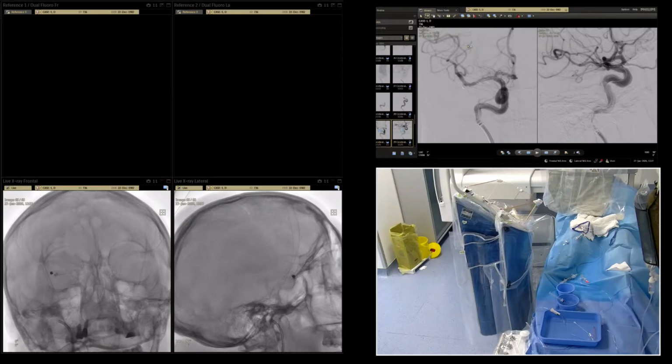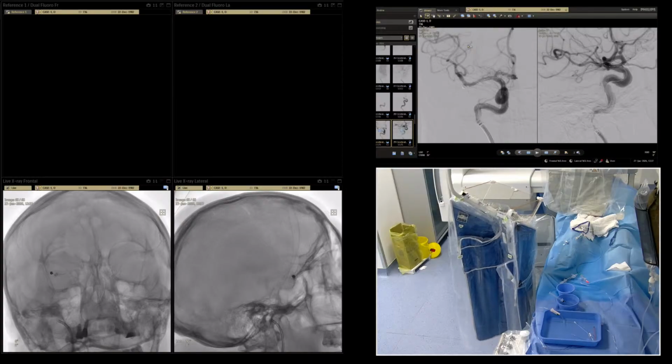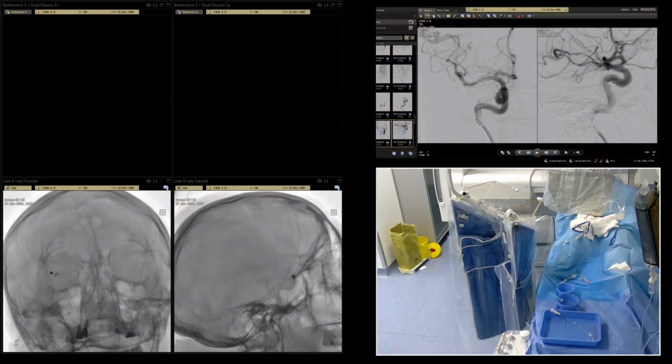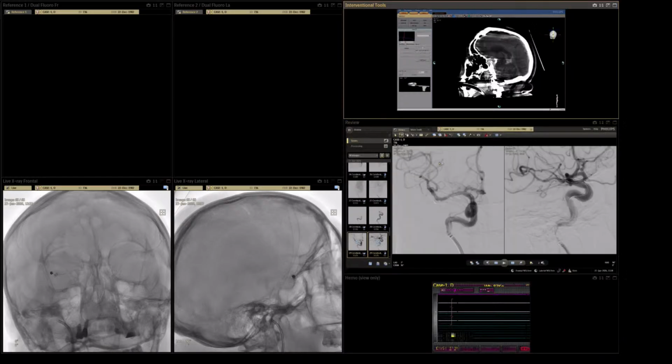It was a decision why we didn't place the silk vista. At this point, maybe 3.5 by 15 is okay. We have no old stock of the devices, that's why it's like this.